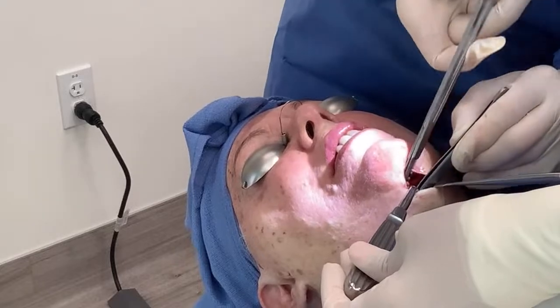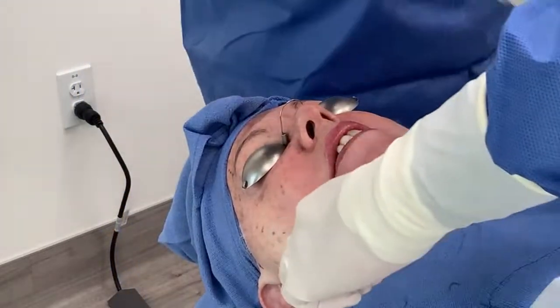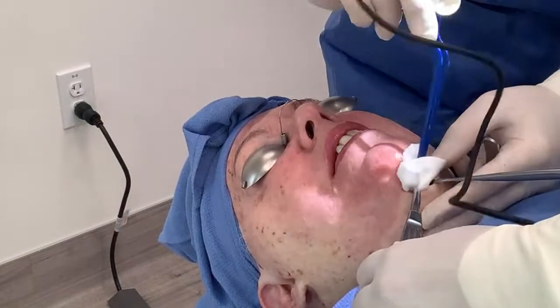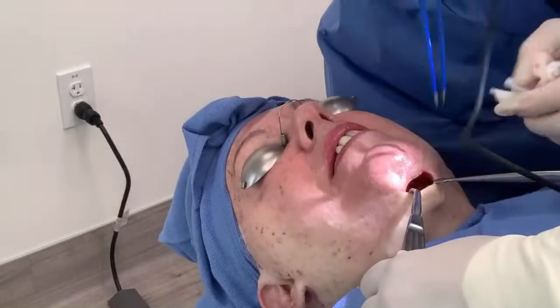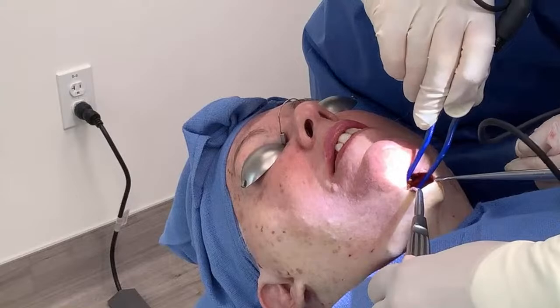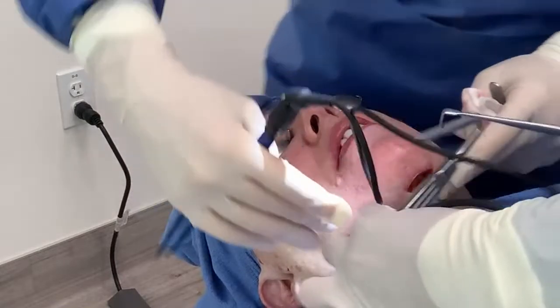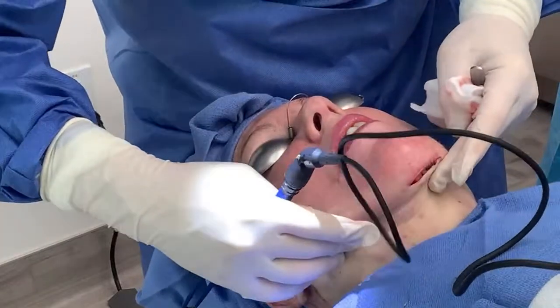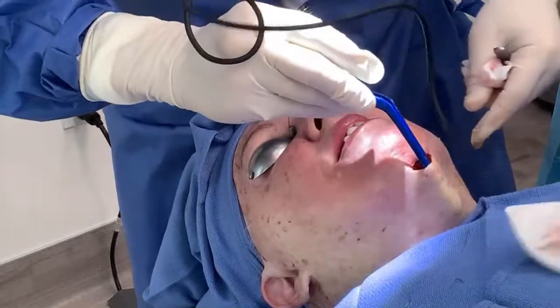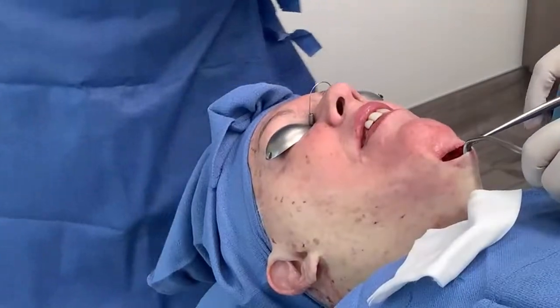And a little bit of cautery here. You feel a little pinch there or not really? No, not a thing. Release totally, please. So I love the profile already. We're winning. It looks so good, but we're not done yet. Over here for me, Gina. Just a little more to go. Then we're going to tighten around the ears.